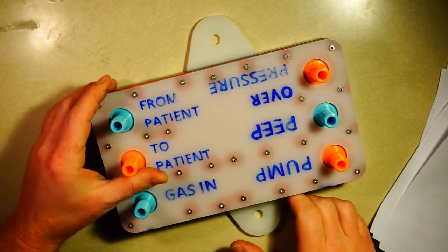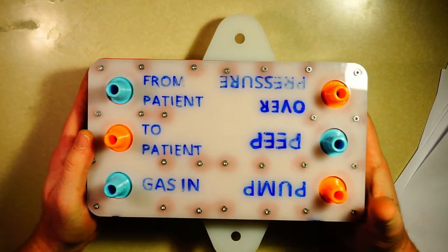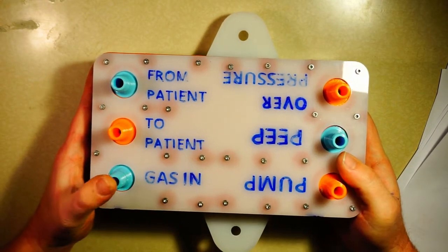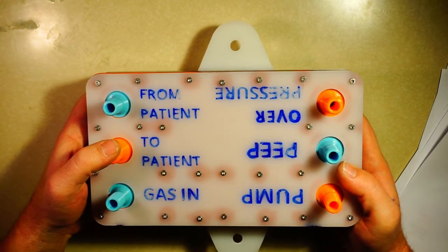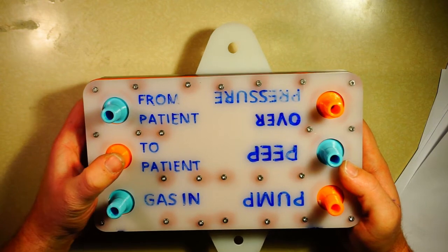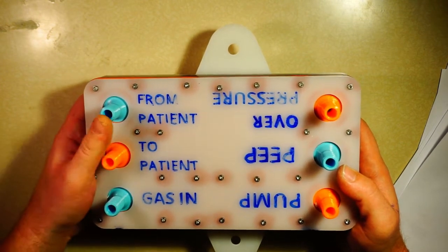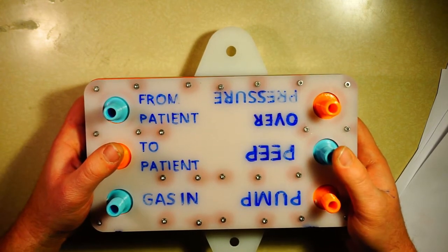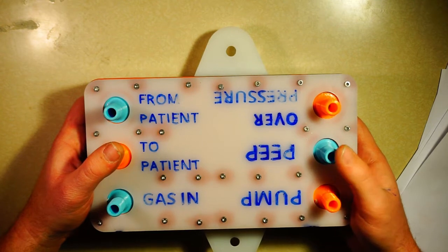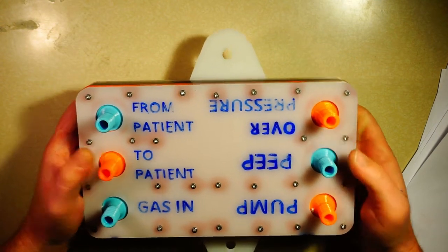Okay, so here is the valve block. It has ports for the pump, the gas in from the Venturi mixer, to and from the patient. These go to the Y tube right before the HME and the nasal cannula, intubation set or mask, and then to the patient. And this goes to the PEEP port on the liquid tank, and this goes to the overpressure port on the liquid tank.